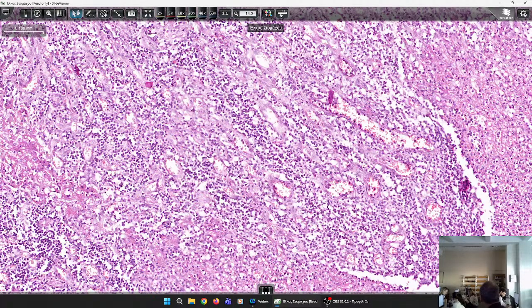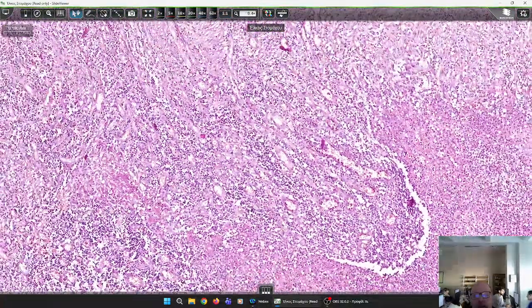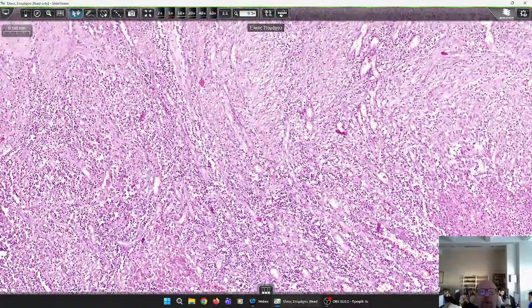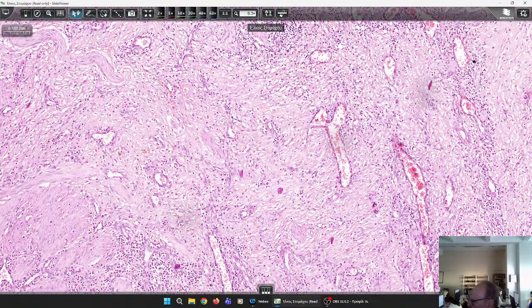This is inflammatory granulation tissue, consisting of newly formed thin-walled vessels, a mixed inflammatory infiltrate, neutrophils, mononuclear cells, and some fibroblasts, which gradually will become fibrocytes and will have scarring on the base. So these all are the layers of the ulcer.